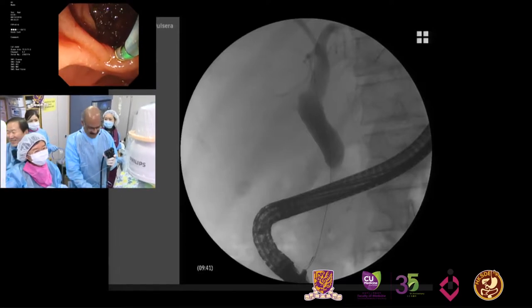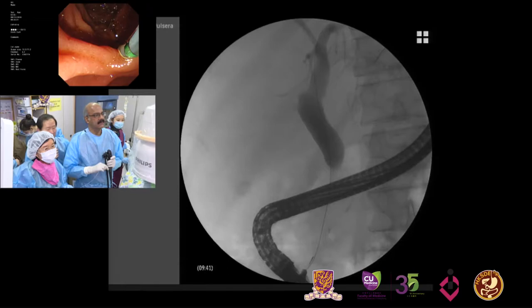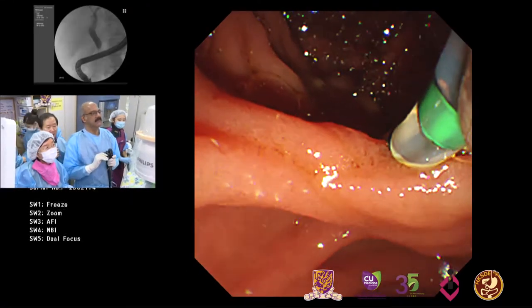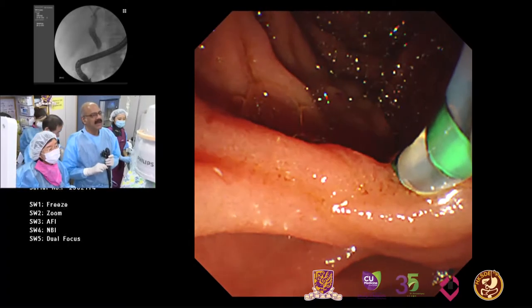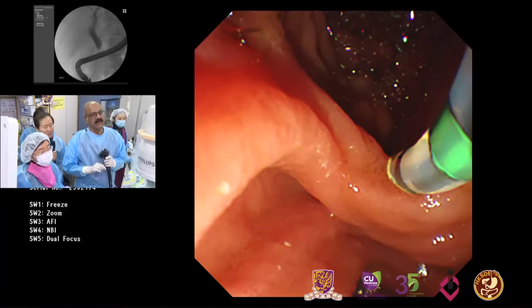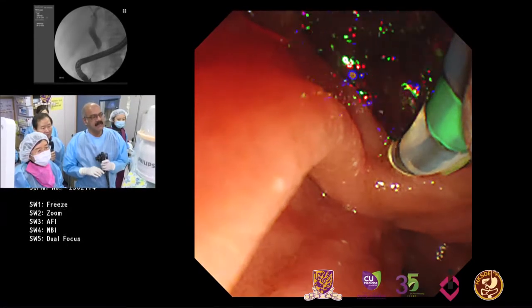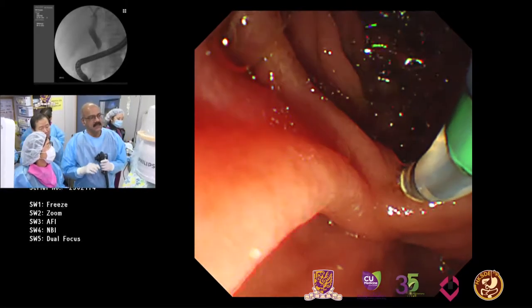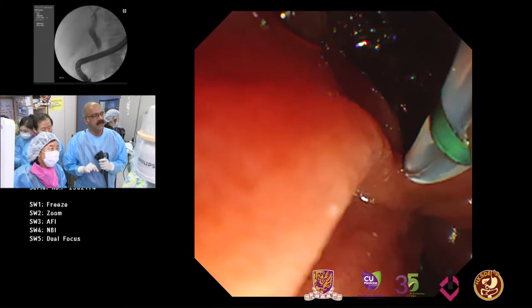Very useful instrument. I find that sometimes it's very easy, and there's a tendency to overestimate the stricture length, isn't it? You're right. Because when you're overconfident, sometimes you've done many ERCPs, you think this is the stricture. Some people, especially the very senior ERCPists, feel insulted to measure the stricture. They say they can make it out there. But I think, as you say, when you're overconfident, you get a wrong measurement.